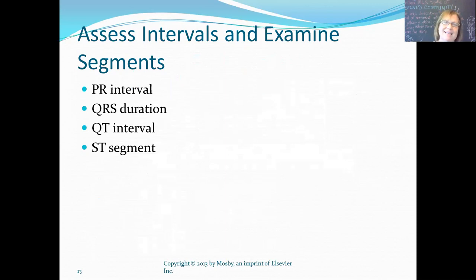And then finally, we look at the ST segment. The ST segment is really critical for us to look at because, if it's depressed, it tells us about ischemia, it may tell us about if we have acute damage, so an MI or some other kind of mechanism that's depriving the heart of oxygen, either in ischemia or actually causing very significant damage when we have an elevation. So that ST segment we really want to pay attention to.